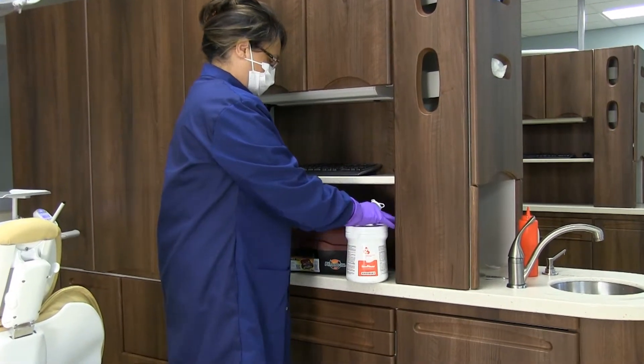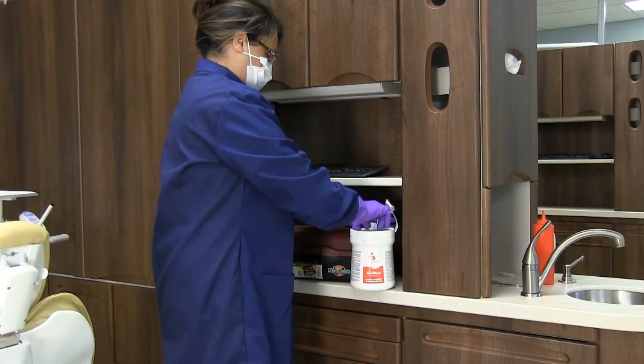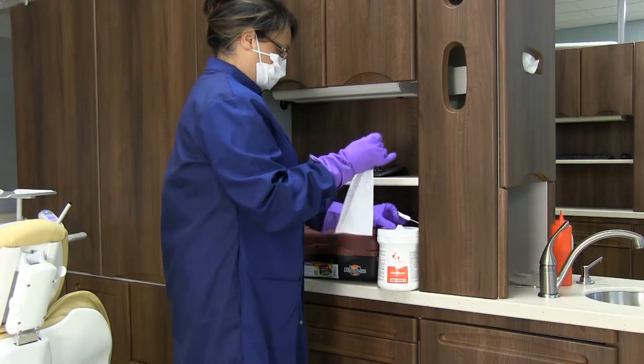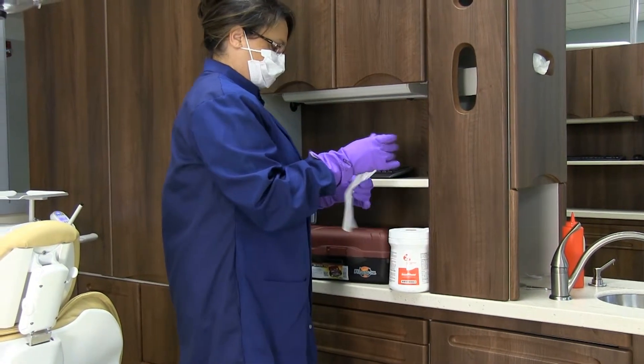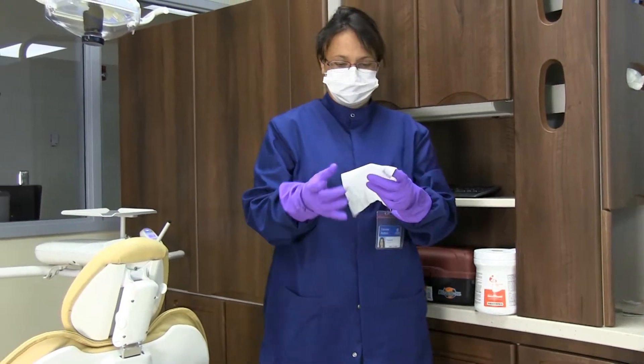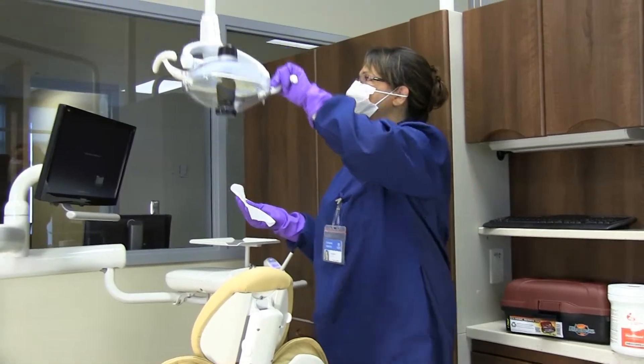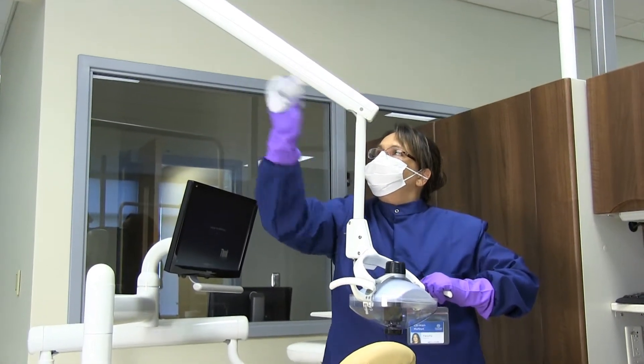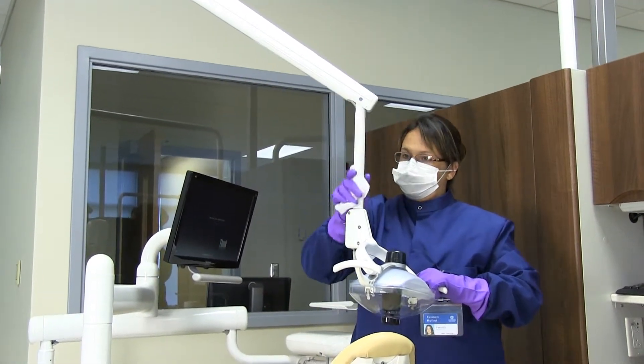For the disinfectant procedure, you will again check the disinfectant wipe container expiration date. Using disinfectant wipes, use the following sequence: the light handles and cover, the front and side delivery system and attachments. Discard that wipe.